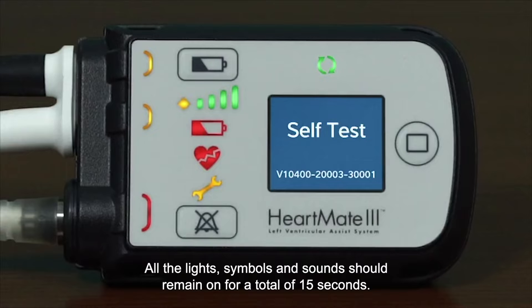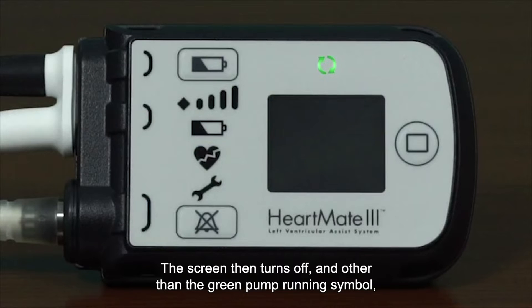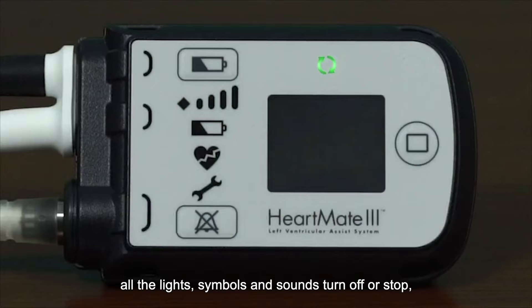All the lights, symbols, and sounds should remain on for a total of 15 seconds. The screen then turns off, and other than the green pump running symbol, all the lights, symbols, and sounds turn off or stop, indicating that the self-test is complete and successful.